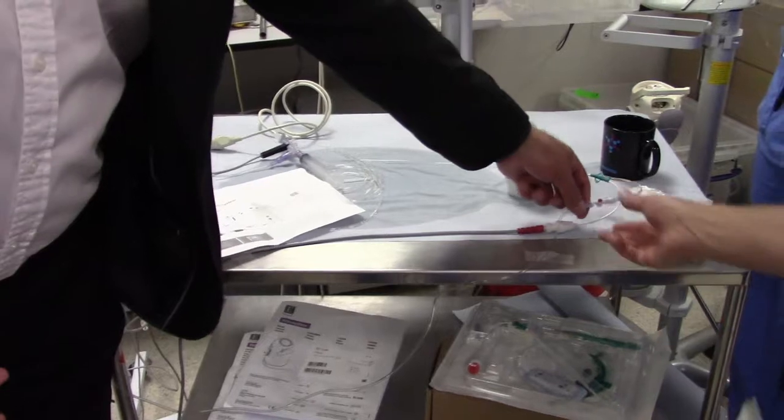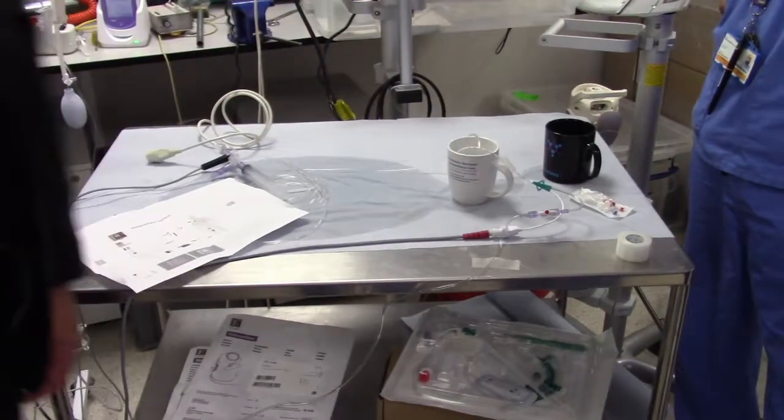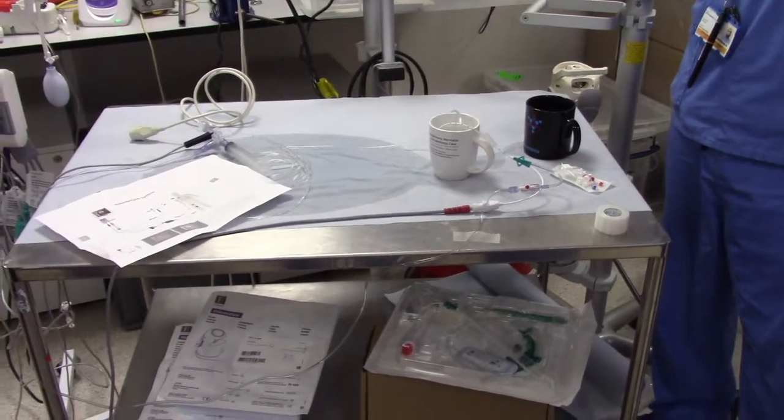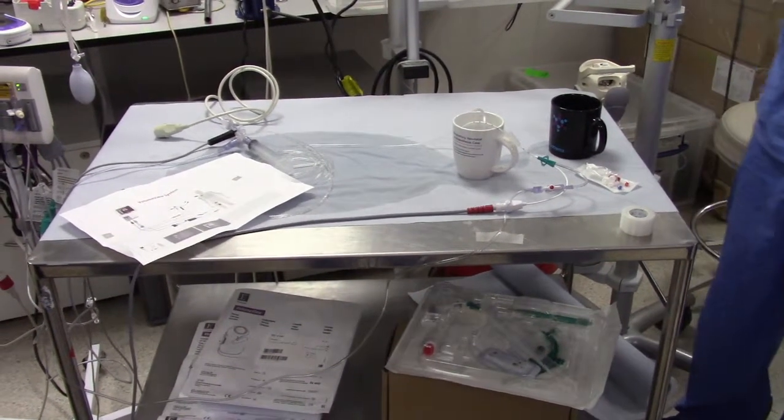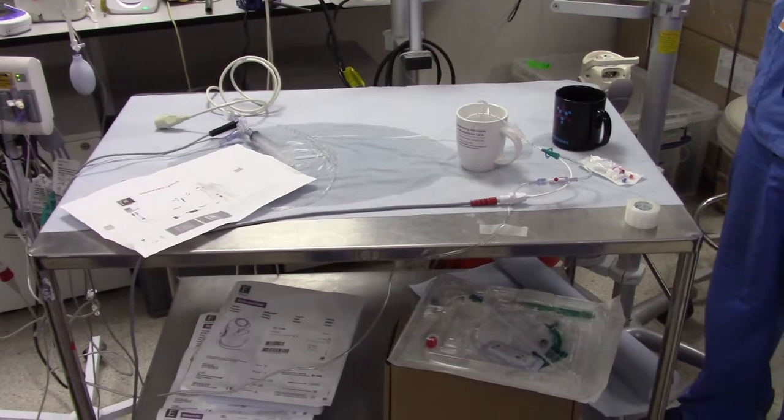Well, I guess it depends on what you've got connected on the line. If you put a three-way stopcock in there, you could. There's no reason you can't, because it's still an arterial line. I mean, why the central line? Why are we going for a radial arterial line?